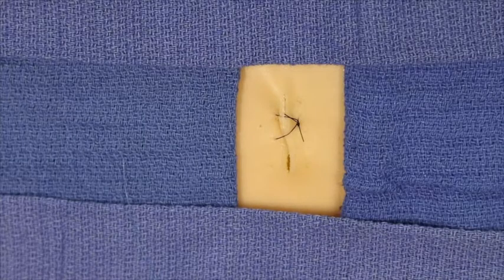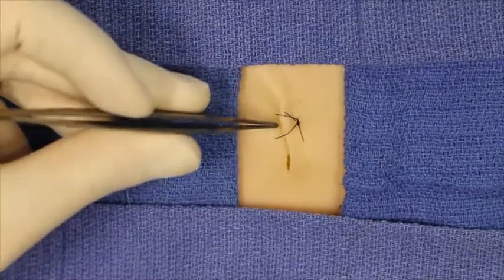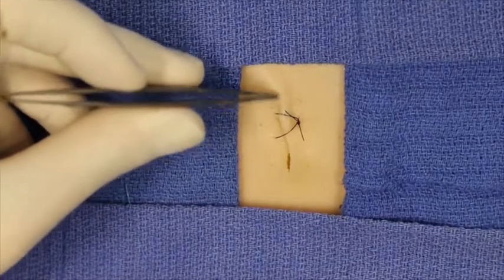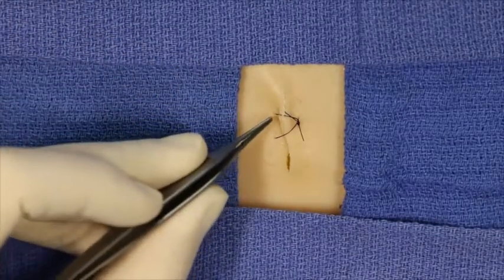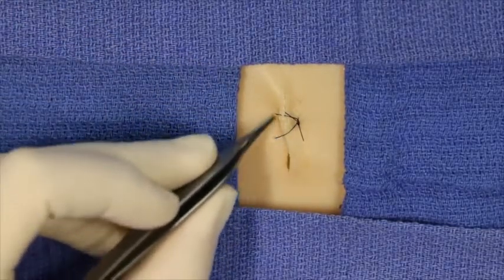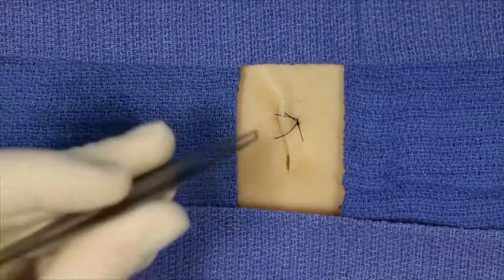Regardless of the technique used, this leads to an everting technique that also provides some hemostasis and some wound edge approximation as well.